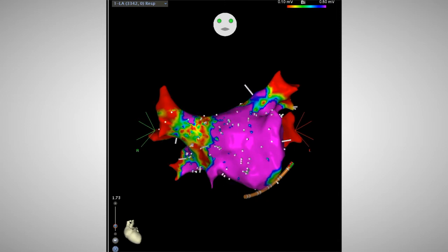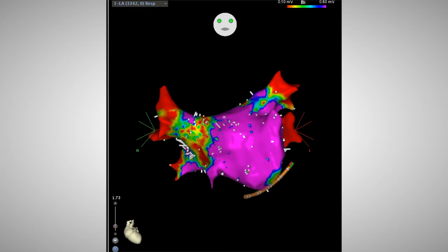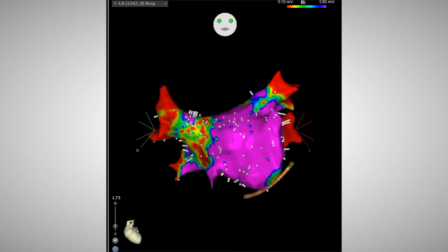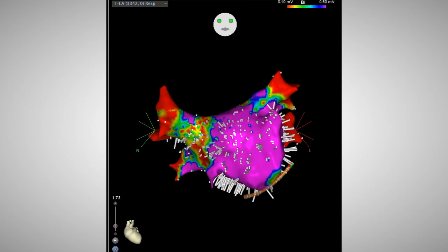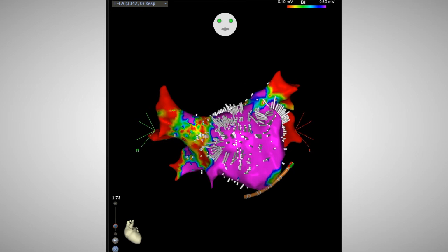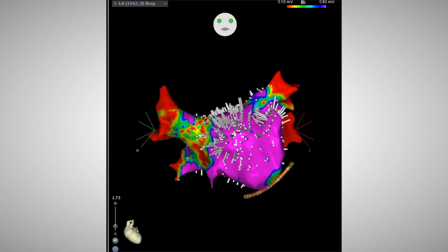The other point I'd like to bring out is that you can see across the map flickers of ripples occurring. And this is just low-level noise from catheter movement or catheter banging. It's random noise, and you think of that as, well, when I'm looking at an electrogram, I do see random baseline noise as well. Well, this is demonstrating that visually. But even in spite of that noise, we can see clearly a wavefront progressing in a fashion that we can understand. And this then is proving remarkably effective at demonstrating what is happening to the right pulmonary veins.